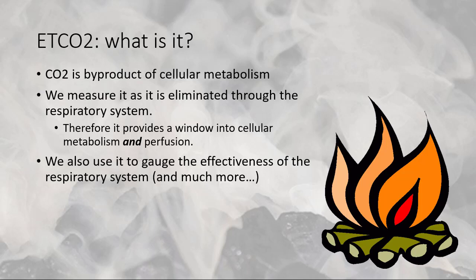So when you breathe out, if you could hear that, at the end of that breath, that's when we measure end-tidal CO2 before we take a breath back in. Because when we take a breath back in, in theory, we should not be breathing in any CO2, and our CO2 levels should immediately drop to 0 in our respiratory tract. Now, we use this to gauge the effectiveness of respiratory interventions, but also as an indirect measurement of metabolism.